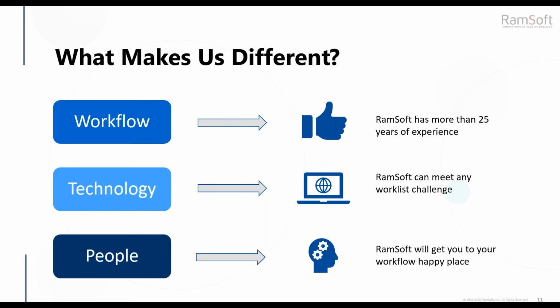So you can always easily modify your workflow. Next, technology. We've developed the technology over the 25 years that we've been doing this, and so we've developed that technology and the process to meet workflow and work list challenges. And then, of course, the best thing is our people. Our staff knows the challenges you face with an inflexible workflow, as many of them have worked in hospitals, imaging centers, radiology groups, etc. Now, we will build a Ramsoft unified work list that increases efficiency to unprecedented levels for you.